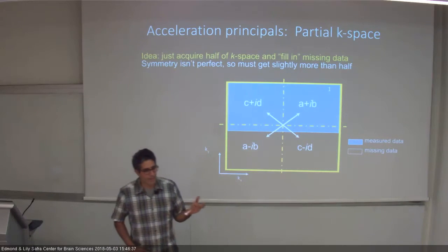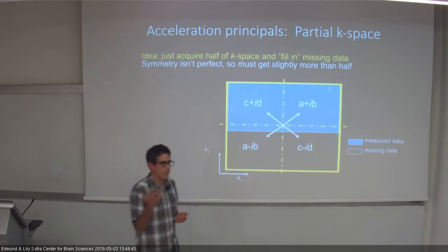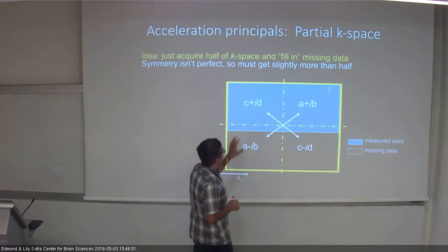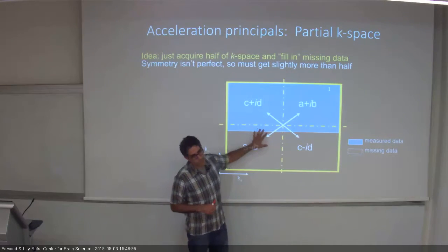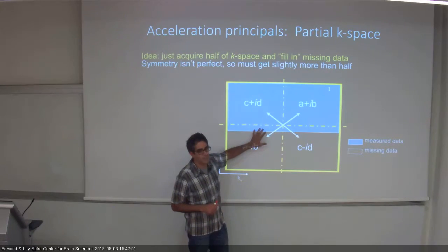Well, it's like JPEG, right? In JPEG we have a full image, but we actually don't use the full thing. It's a compressed sensing approach. Have you heard of compressed sensing? The idea in compressed sensing is that I'm going to only measure a subset of my image, or subset of my space, in this case K space, and in some way I would use the fact that there are some similarities in here. They are not totally independent.